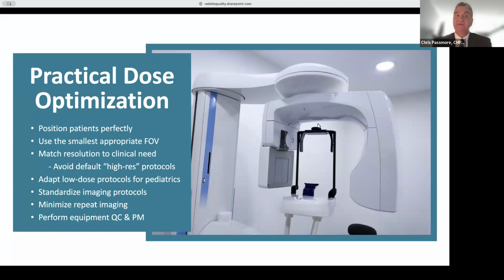Yeah, I would also add that the Joint Commission, probably 5 years ago or longer, came out with guidance for hospitals, medical applications for CT scanners to optimize the dose, to basically review the protocols, ensure that you're using the proper protocol. Say, for example, that you're not using an adult protocol on a child. Things like that, as Vino had mentioned, very important to look at what protocols you are selecting.